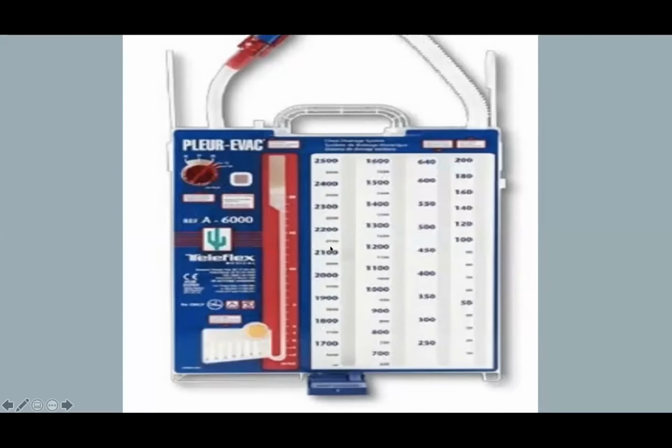This is another pleurovac actually, which has a scaling button that is shown here. This will help you a lot because you don't need to scale your suctioning on the wall or in the portable machine. You just connect the suction, and you will know that the suctioning power is appropriate whenever you have proper suction, because there will be an orange cube that will jump upwards here with the suction.